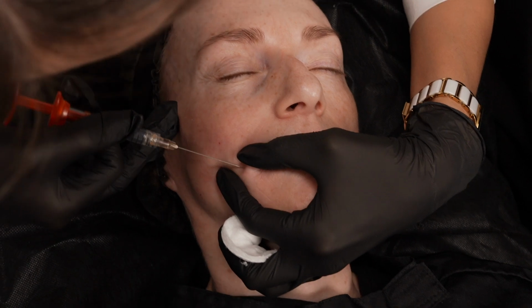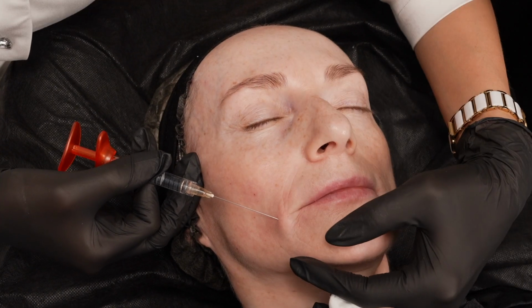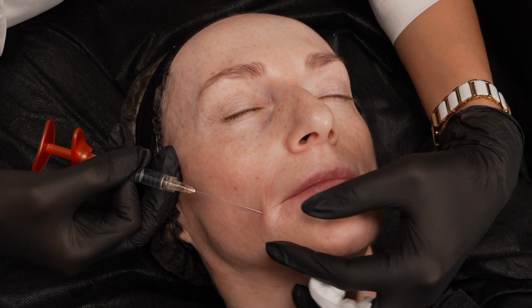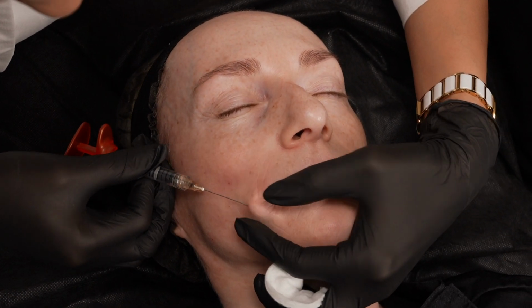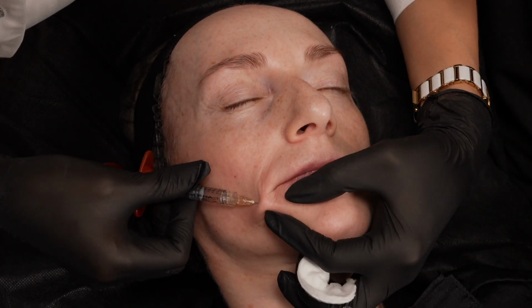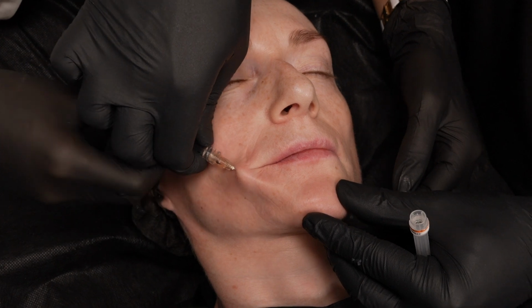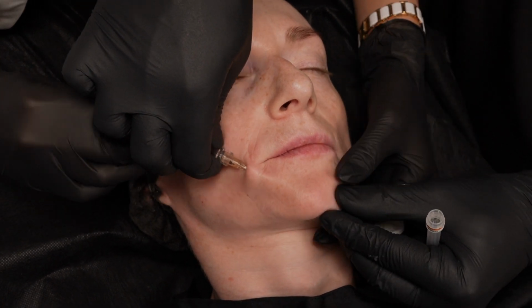Там сколько у вас осталось? Yeah, you can do with needle, but we have cannula. She knows how to do that. Yes, with a needle. She wants to try it. Yeah, exactly. Try it. Нет, там 0,5 нет, по-моему. 0,5, да, 0,5.